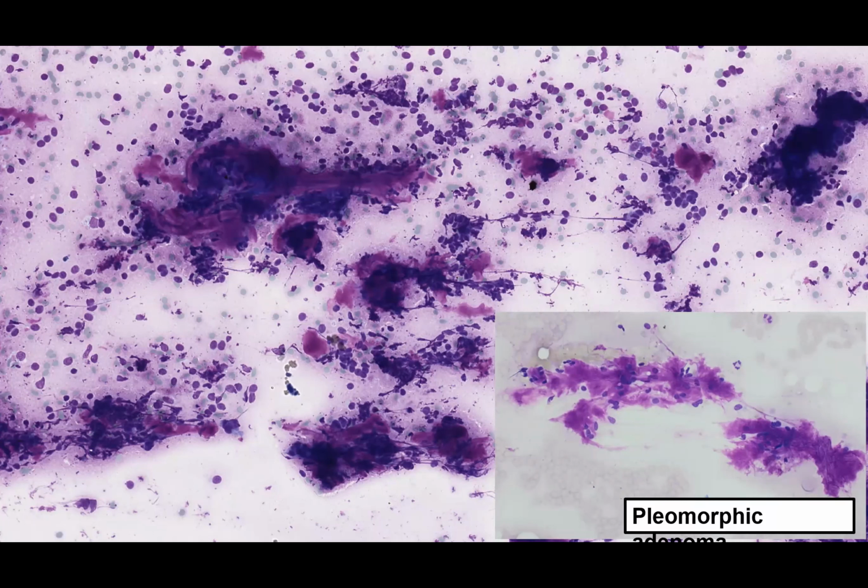Here I've got a pleomorphic adenoma, the prototype that we always think about with fibrillary magenta matrix. Some people liken it to troll hair, with very few epithelial cells. On final histology, this turned out to be an adenoid cystic carcinoma. This is the importance of trying to put it under the SUMP category, because there is going to be difficulty in whether this could be a benign or malignant category, and these confer different managements.